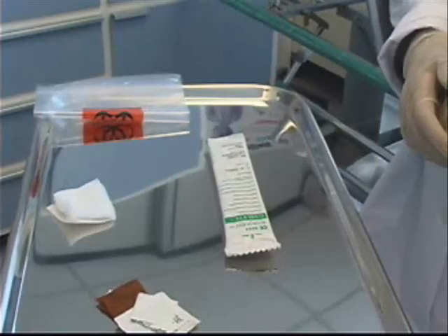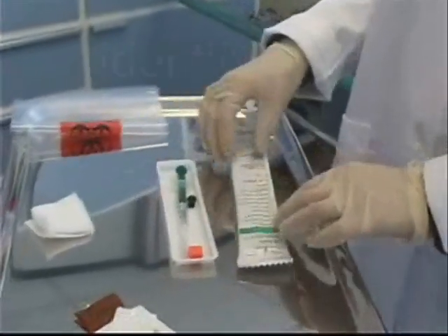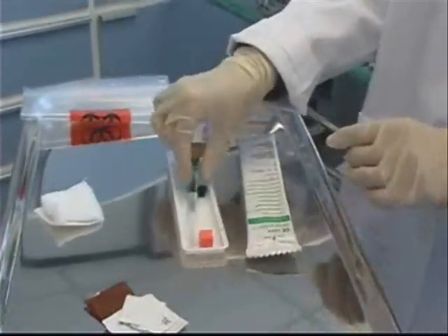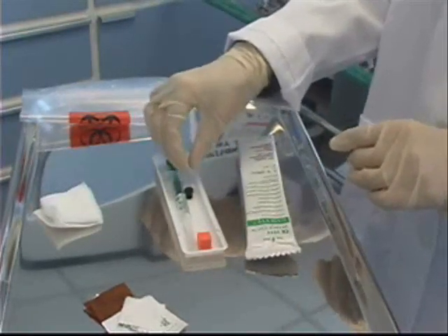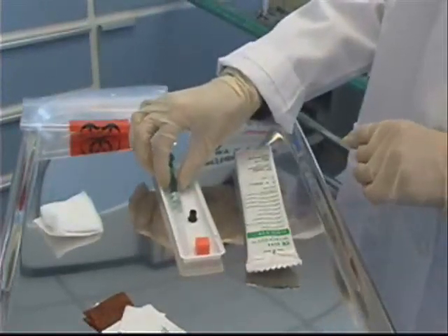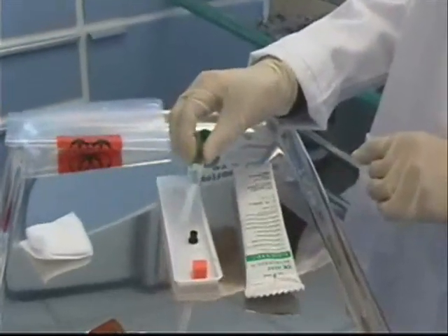While I'm waiting for the skin prep to dry, I can open my blood gas kit. The kit is made up of three different pieces: first, an orange air ball, which I'll use to expel any excess air from the syringe; a black cap to go over the syringe for transport to the lab; and a 3cc heparinized syringe with a needle attached.